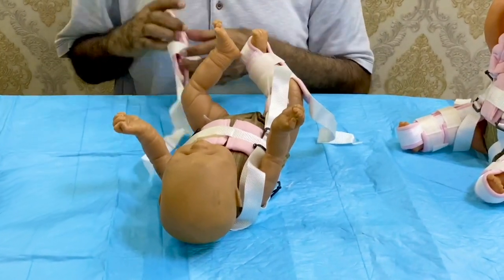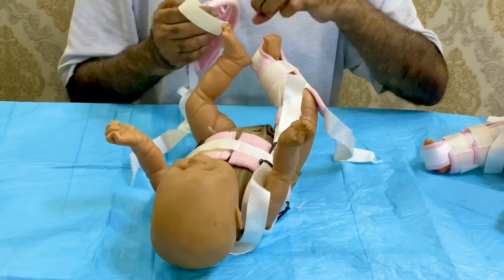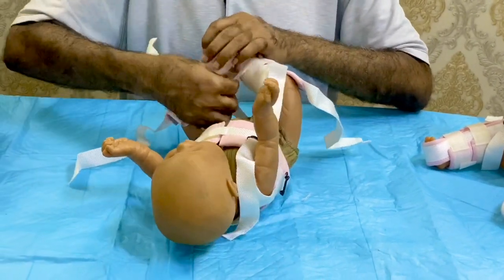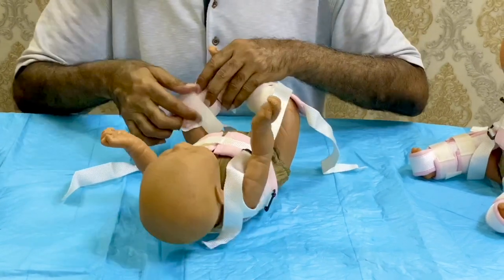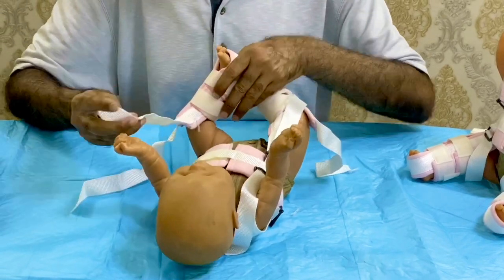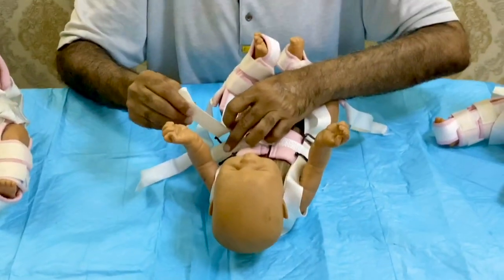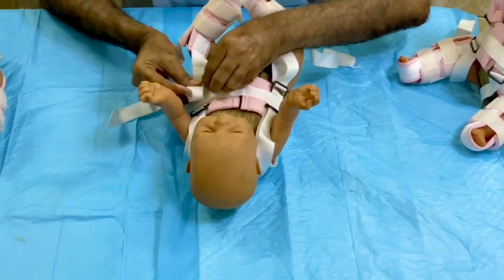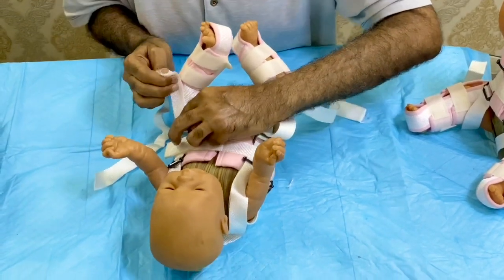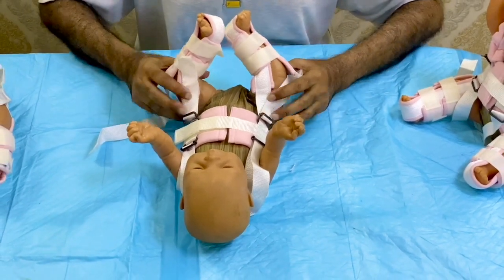Then apply on the other side using the same method. Apply the flexor strap and fix it in the 90-degree position, maybe up to 110 degrees maximum. This is called the flexor strap, so this is the flexion of the hip which you have already reduced.